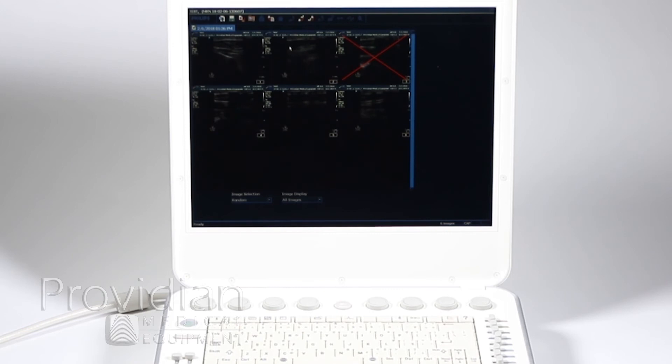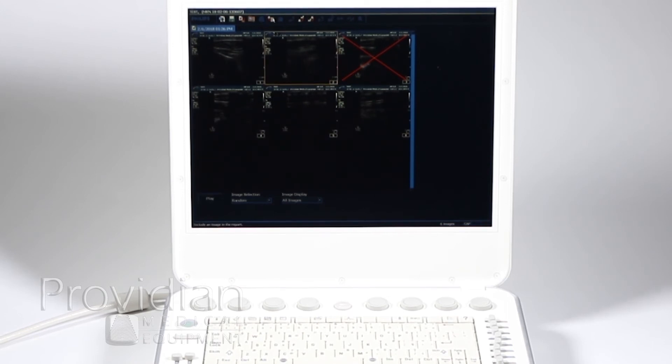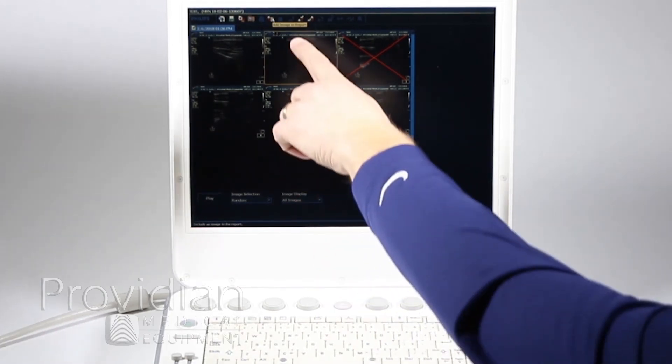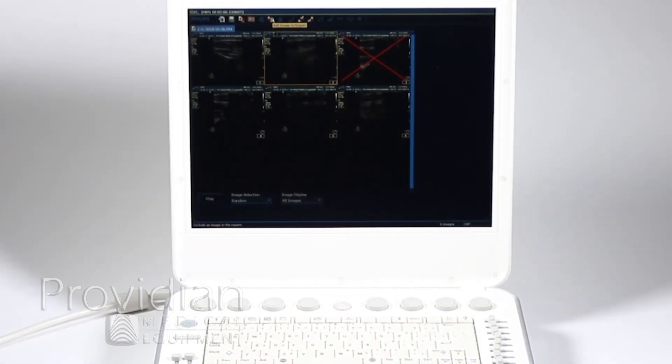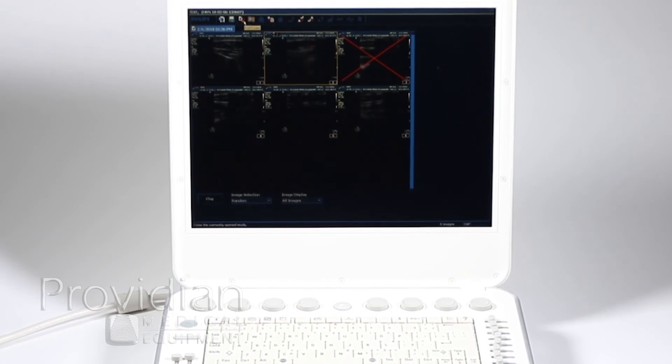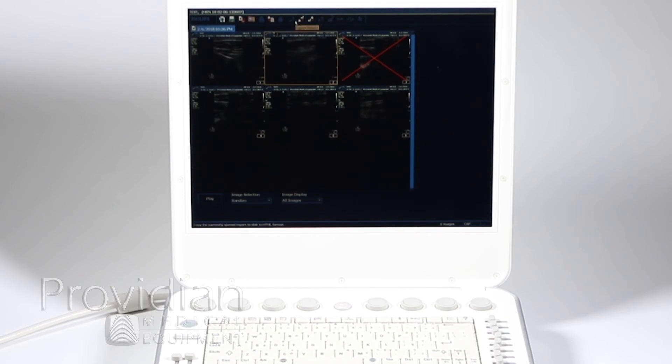And you can also add images to the report—I can click on it here and up here it'll say Add Image to Report. And I've already added it, so it won't work again. I can end the exam from here if I want to move on to the next exam, import studies from another system, or export the selected images.